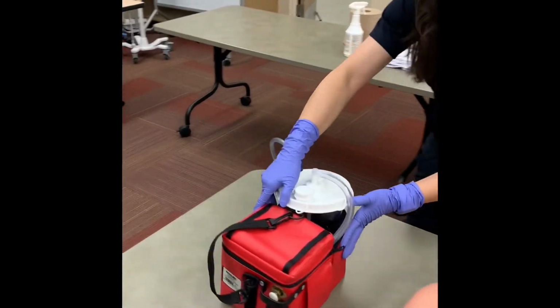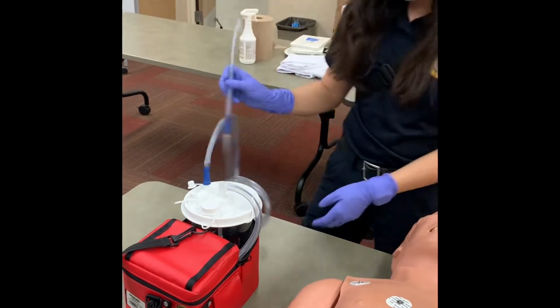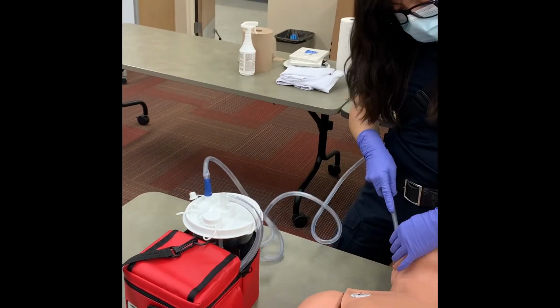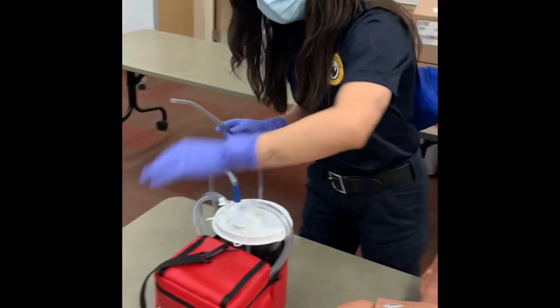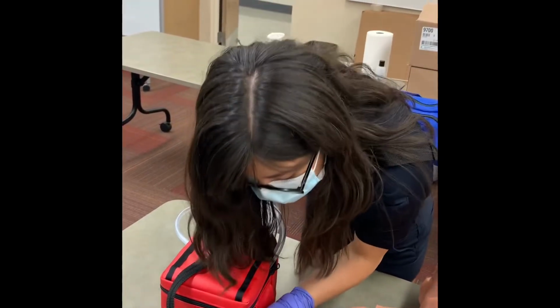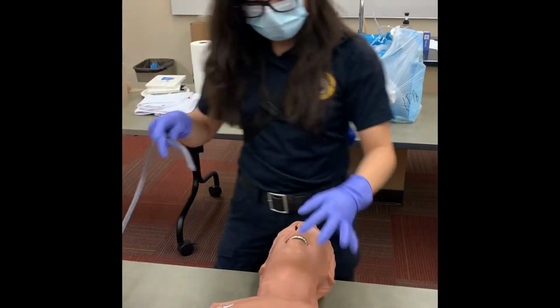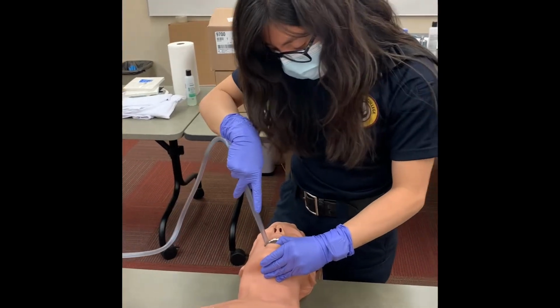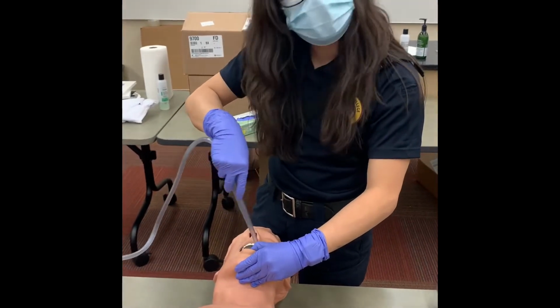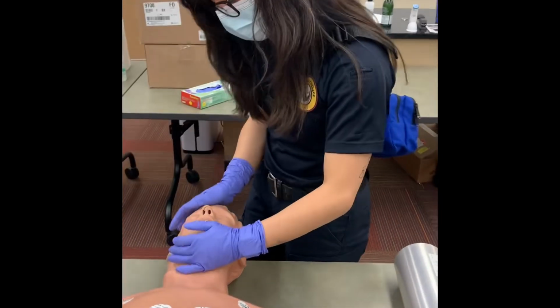I'm gonna get my suction device, and I'm gonna get a rigid suction catheter. I'm gonna go ahead and measure it from the tip of the earlobe to the corner of the mouth. That would be as far as I could go. We would turn on our suction. Okay. As I'm inserting, I am not covering the hole. So I'm going in and I'm suctioning on the way out using a sweeping motion. All right, and the mouth and oropharynx are now clear.